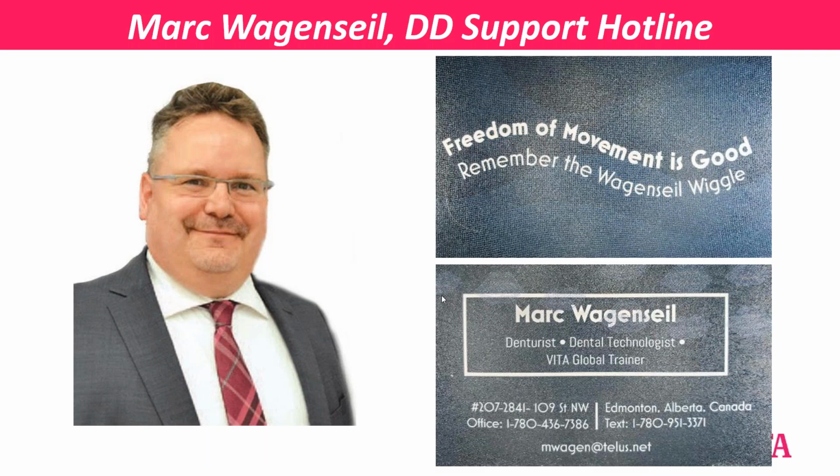Then that tells me, should we be changing a lot? So if the doctor wants to open the vertical 5 millimeters and you see a person that's got bruising all over them, well, what does that tell you? It tells you they bruise easily. What do you think the denture is going to do in their mouth? The denture compresses down on the gum and is squishing and creating hydraulic pressure. It's going to bruise it. So we have to build it for the person.